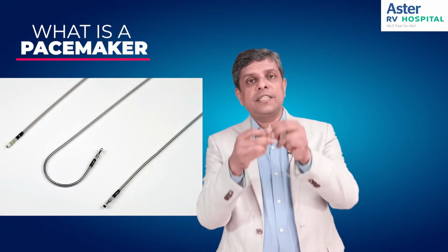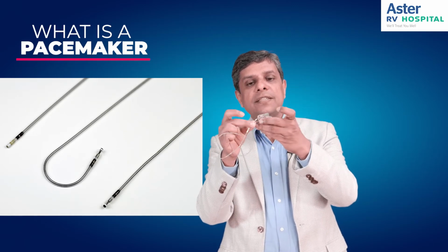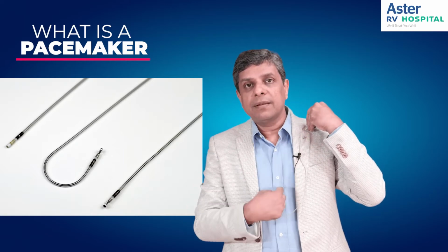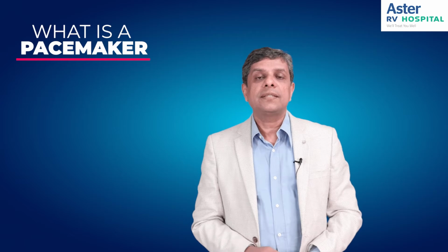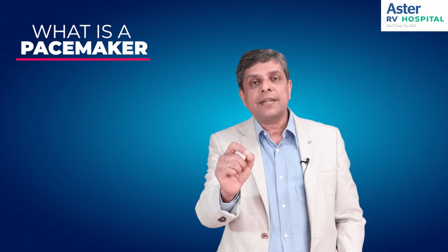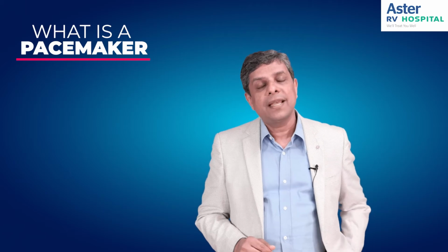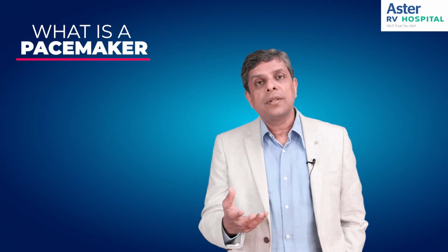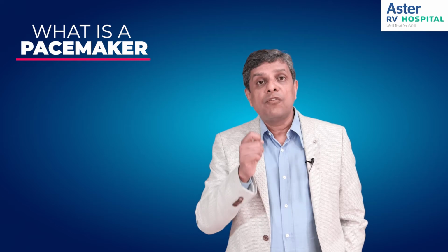So now this is a wire. These are called leads. One end of it is attached to the pacemaker. The other end goes into the heart through a vein. The tip of this wire has a sensor, and it detects the impulse which is generated in the heart. Let us say either because of sinus node disease or because of heart block, the heart is slow. The pacemaker is able to detect that, and then the pacemaker fires the heart.